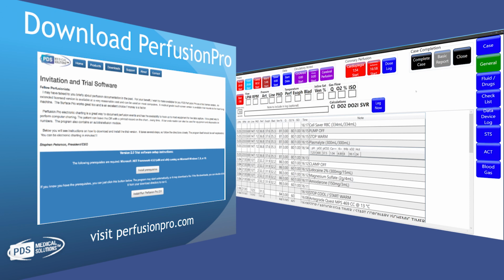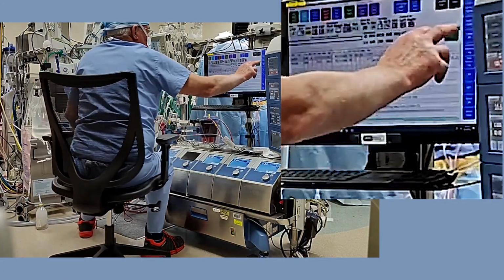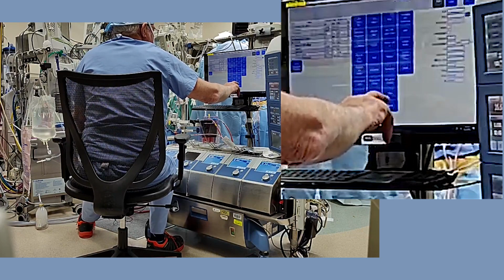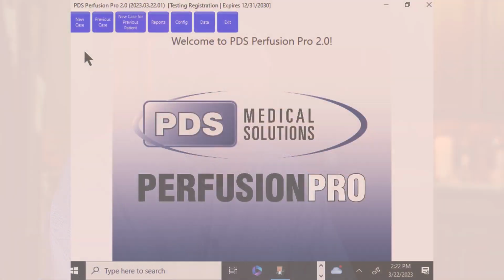Perfusionists have a variety of tasks. These variety of tasks can distract a perfusionist from the documentation or just from the patient. So you need to be able to make sure that this all works out together. It's very rewarding to have good results, and to have good results, you need good documentation. For the past 20 years, I've been working on a program that actually documents this information we've been talking about.